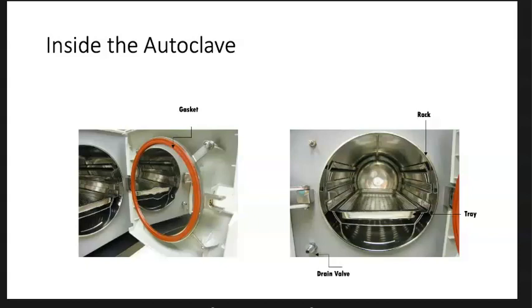The gasket on the door must be inspected for its integrity, as these can dry out and then you will lose your seal of your autoclave. So autoclave maintenance and inspection is imperative to our instrument sterilization process.